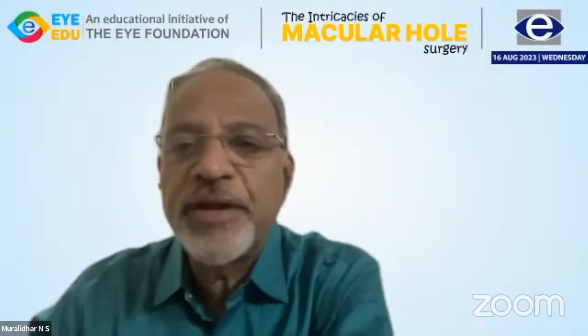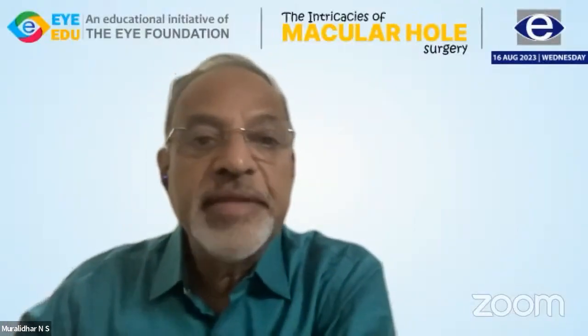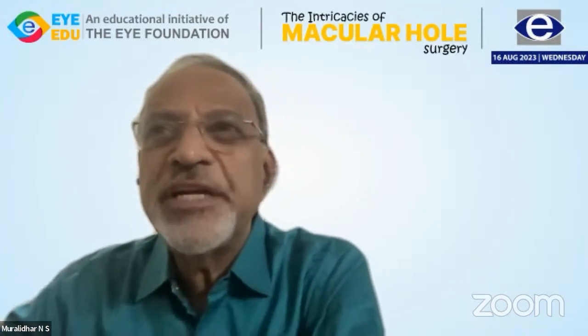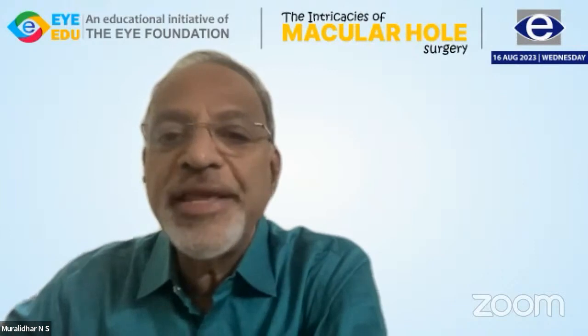Ashreya, if you have time for just a single question. Yes, sir. Go ahead. I was quite interested to see that Dhaivat mentioned the use of SF6 in the patient he operated. In my own practice, I generally tend to use only air when I'm operating on a lamellar macular hole or an ERM.